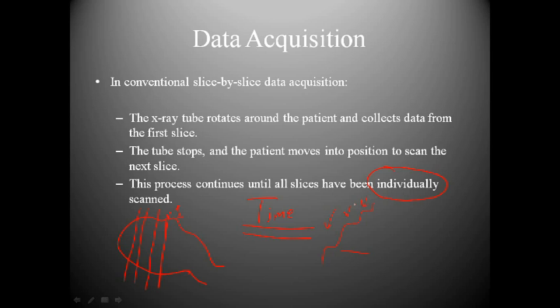And so the ER physician's reaction was, okay, go ahead and do that. And so I had to bring the patient back over, scan them again in a helical fashion, and then reconstruct those images as well. To make a long story short, that kind of spurred us on to utilizing helical scanning, and we really haven't looked back since.